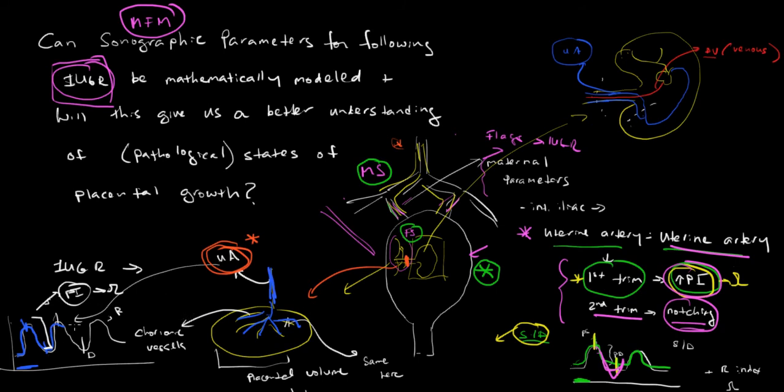You could start to see problems in the diastolic flow, where the diastolic flow really tapers off. And in the worst case scenario, the diastolic flow could actually move in the opposite direction, suggesting that most of the time the blood is going this way, but during a tiny portion of the cardiac cycle, blood is actually sloshing backwards. The term that they use is abnormalities of end diastolic flow, and the serious term here is reverse end diastolic flow. When an obstetrician sees reverse end diastolic flow in the fetal circulation, that suggests, and I'll oversimplify, that the resistance is so high in the fetal circulation that basically all the forward flow is spent during a certain part of diastole, and come the end of diastole, blood is actually sloshing backwards.